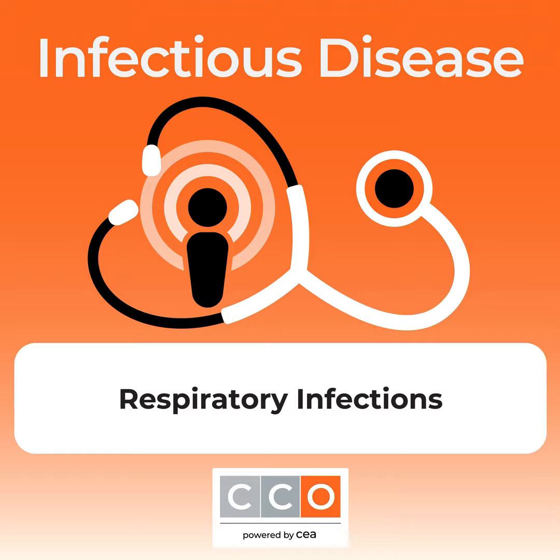Are the results going to influence your patient's care or outcomes? For example, with the pneumonia panel, is your patient at risk of having an infection due to an antibiotic-resistant organism like Pseudomonas or Acinetobacter? If they are, then maybe this panel would be quite helpful, because those may not be organisms that we would empirically treat for community-acquired pneumonia.